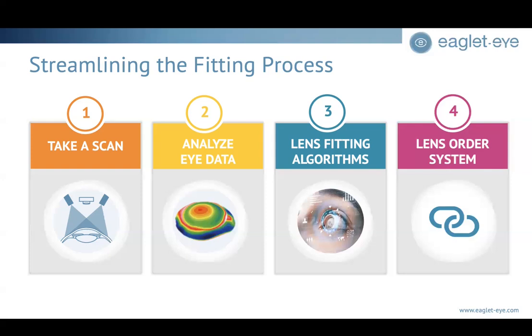Some days we actually like to have consultants available to us with a simple click to be able to pick up and either design a lens from scratch or help to make modifications depending on what you need. And so the way that the software works in the lens ordering systems, it can be as involved or as much or as little as a practitioner wants. So take the scan, look at the data yourself. In our clinic, what we actually do is we'll take the scan and I look at it, number one, in the clinic to figure out what kind of a starting lens might be appropriate to determine power.